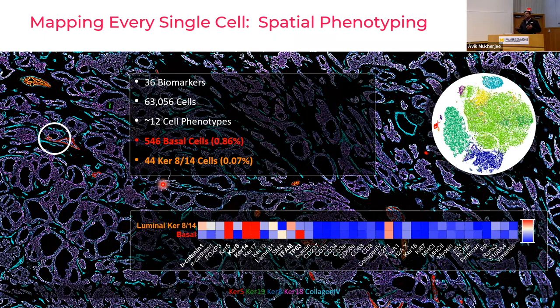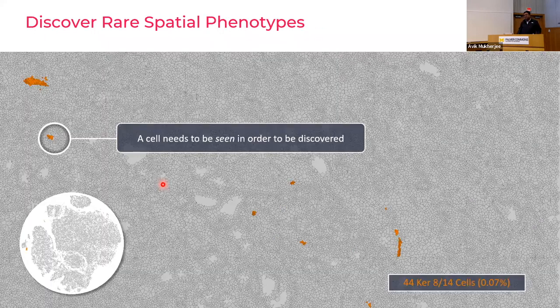whether the number of the cells, the position of the cells, the location of the cells can have a further outcome. And the most important thing is you have to visualize and find those cells before you know they exist. So if you are picking up regions of interest, there's a greater chance you miss this kind of discovery.